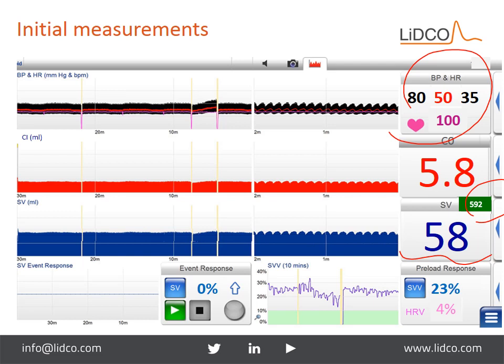So let's march it out. Is our patient perfusing adequately? No. Does our patient need fluid? Yes. Do you think our patient, if given fluid, will respond? Well, we have stroke volume variation down here. She meets the criteria to use that number that is valid. She's on more than 8 cc's per kilo. She has a closed chest. She has a regular heart rate. So we can trust this number. And it indicates that she will respond to fluid. So that's what we do.